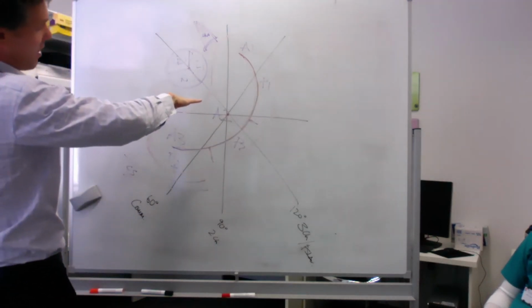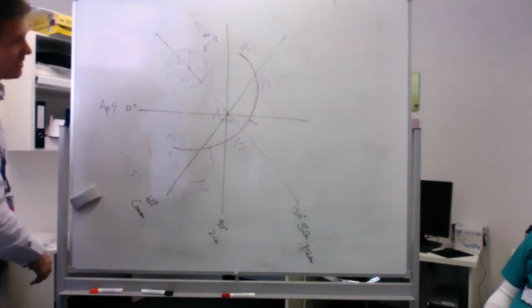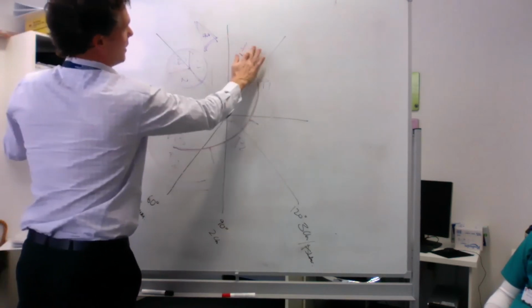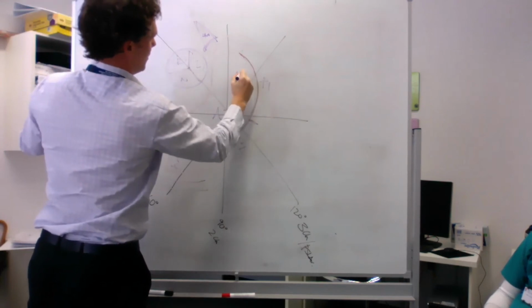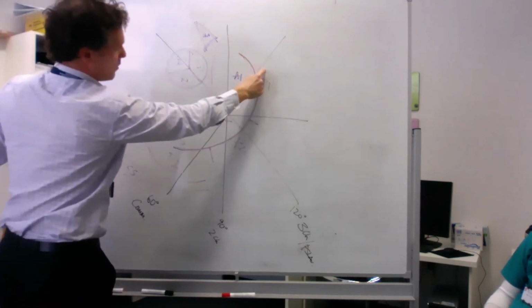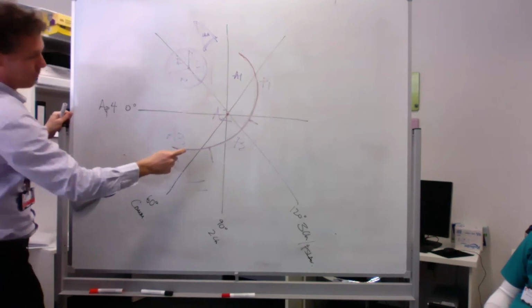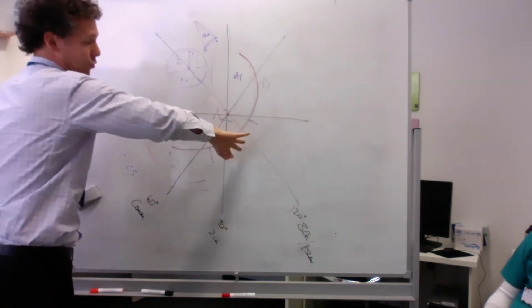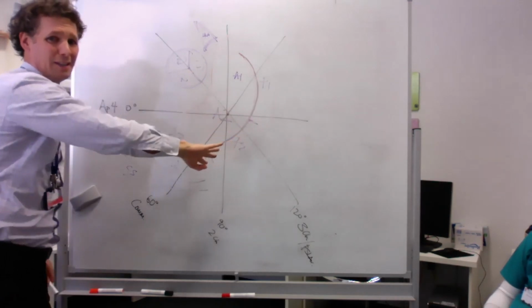And then from there, I switch it around about 60 degrees, and that will give us an idea if we're looking at A1, because I go through P1, A2, and P3. If I fan that up and down, I can look at A2 or down into P2.